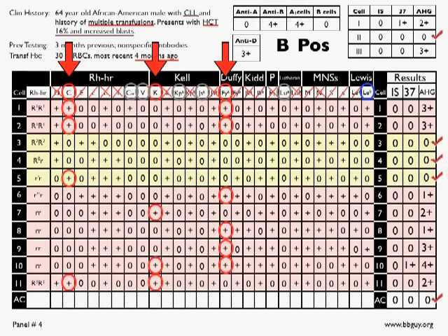So with all that being said, by the way, I did want to point out that cell 7 doesn't work for this. And in addition, this is important to note. If you take a look at cell 10, you might think that the Duffy might explain it by itself, but actually, that's a really strong reaction, and it's a single dose of Duffy A, so that 4+ doesn't really make sense.